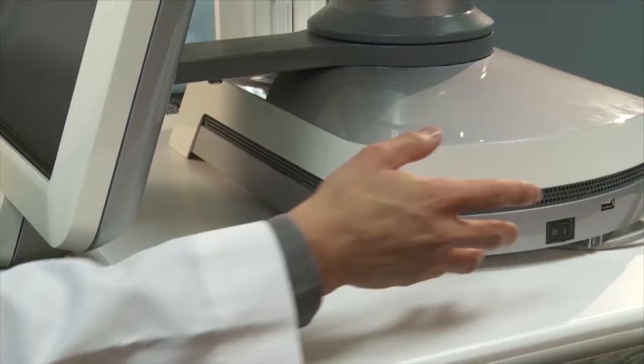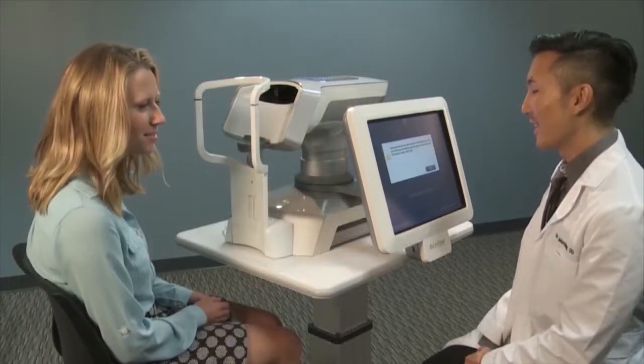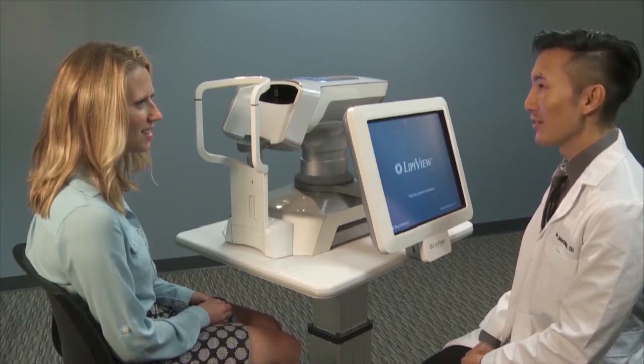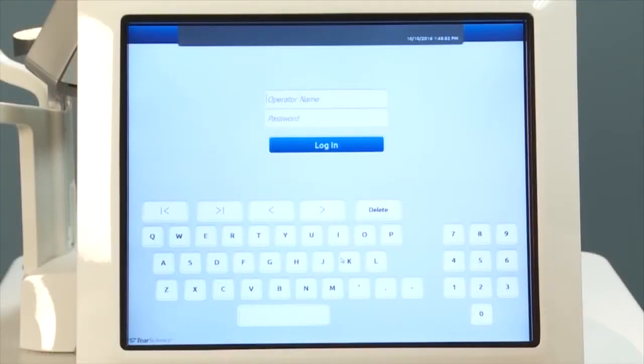Power on LipiView 2 at the device base. Ensure the patient and operator are clear of the chin rest area and press OK. The system initialization will take about 20 seconds, when you will notice the motion stage will self-adjust. Touch anywhere on the screen to continue.